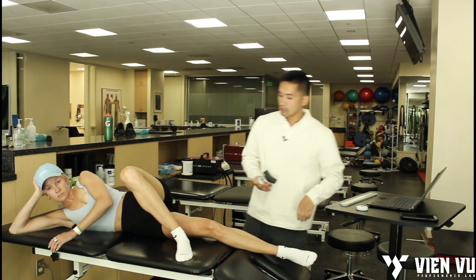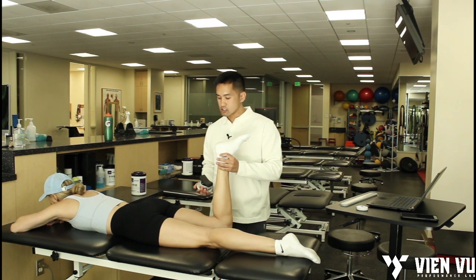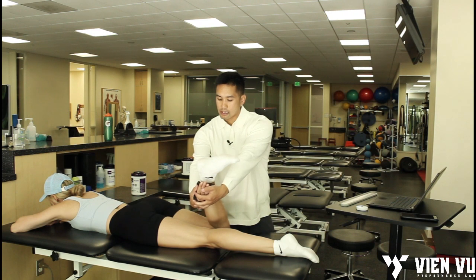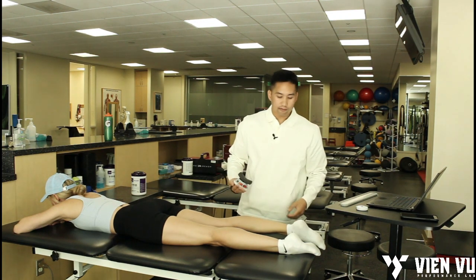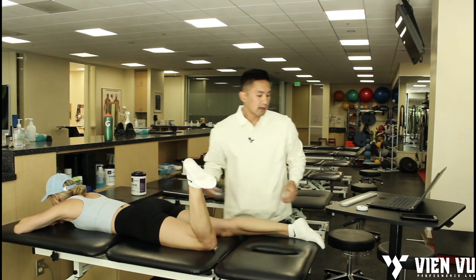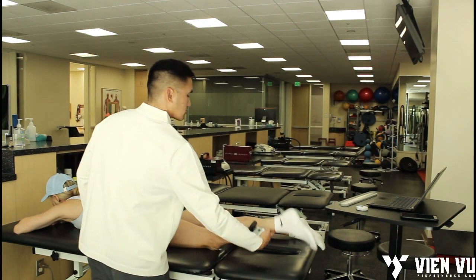Next I'm going to have you lay on your stomach. I'm going to test external rotation of your right side — your involved side. I'll have my arm position here, and I'm going to pull. Resist me as best you can — and go, fight it, fight it, and rest. Then from there I'm going to test internal rotation — start here, and go, fight it, fight it, and good.